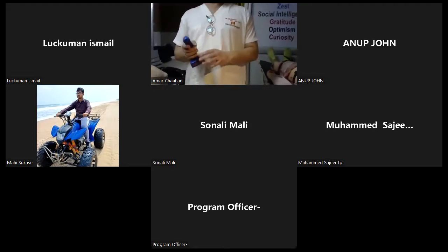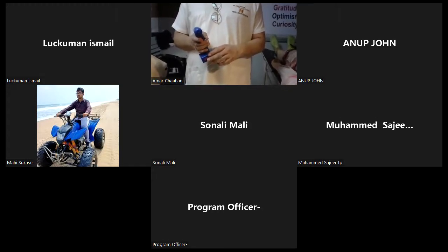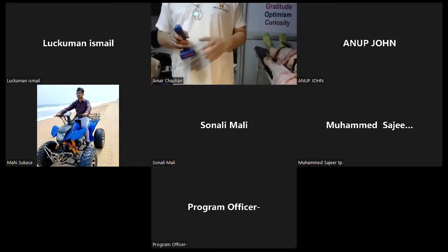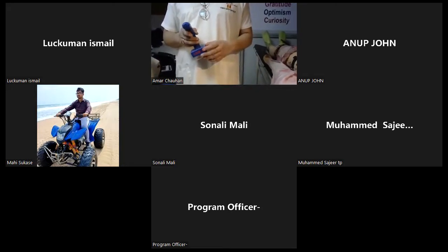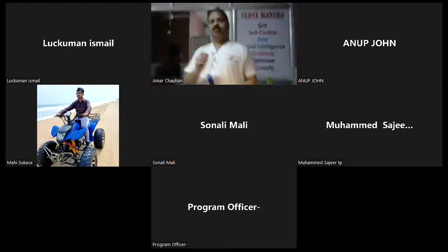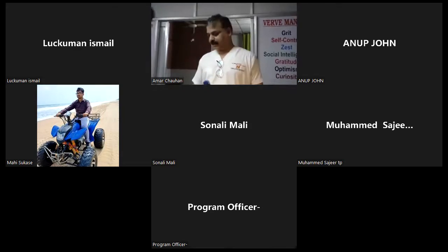We have mentioned it in the brochure, IO access and power driver. We have a separate catalog for that. Lukman will share it regarding that 300 plus charges, LED indicator for battery, magnetic. Hold on, I'll send our catalog, the booklet for the IO access.